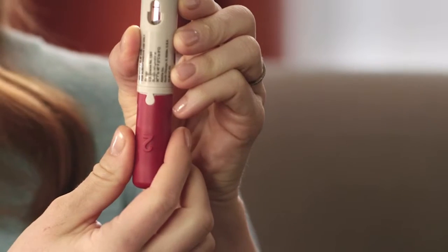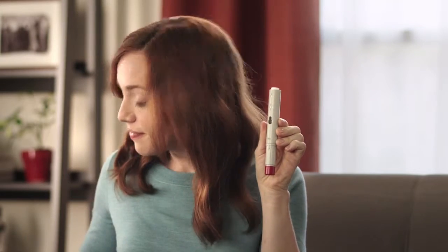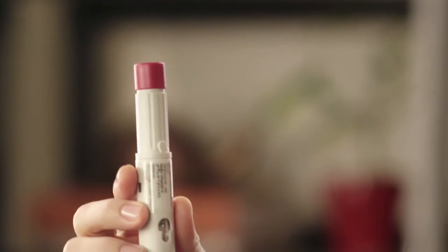Now, from the bottom of the pen, I pull the plum-colored cap straight off, which will reveal a plum-colored button. I flip the pen so that the plum-colored button is now pointing up and hold it so I can see the window. I'm still not pressing the button just yet. Now, I'm just about ready to inject.